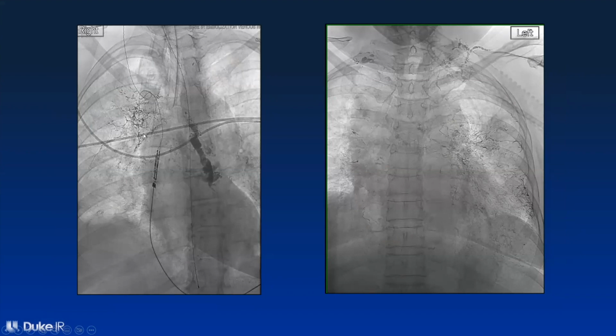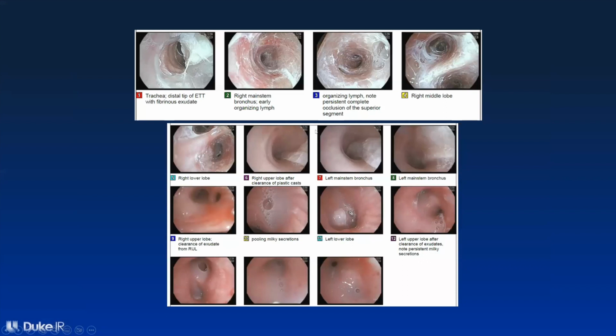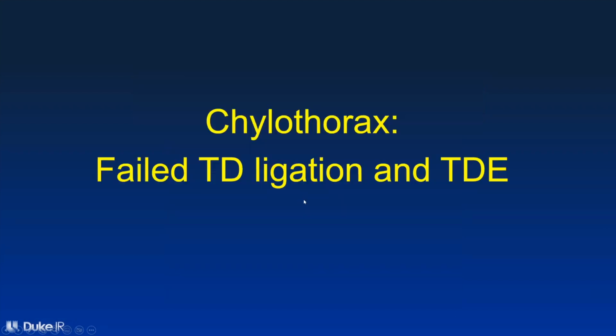They have a lot of large and numerous lymphatic vessels where they shouldn't have them. So what we do is, again, we embolize or block the thoracic duct. This is the bronchoscope before treatment and a couple days after treatment. And eventually, most of the time, this resolves and they stop producing those white casts.